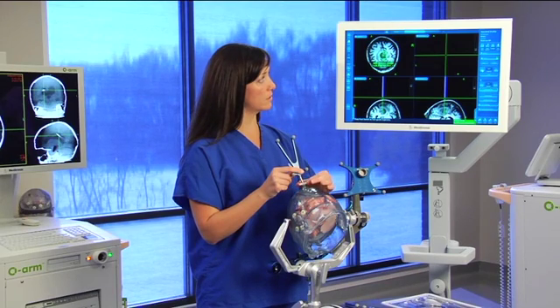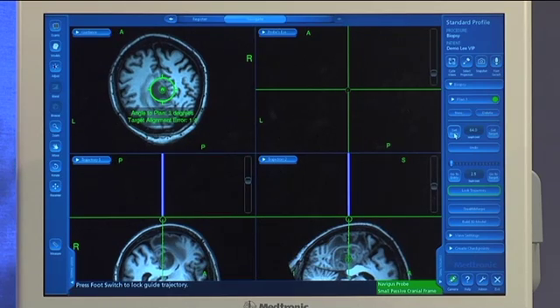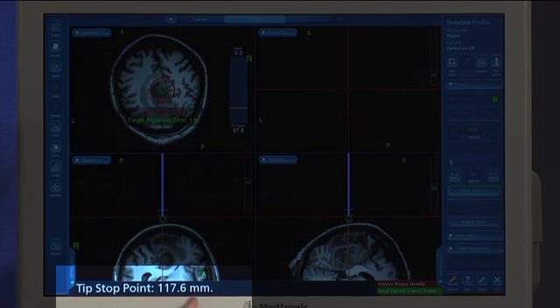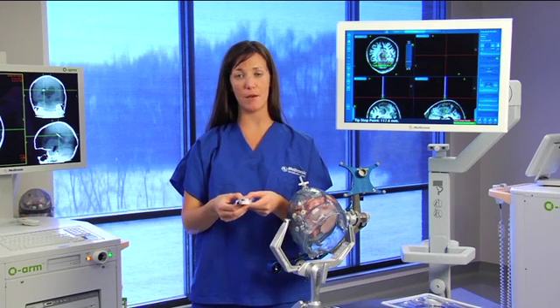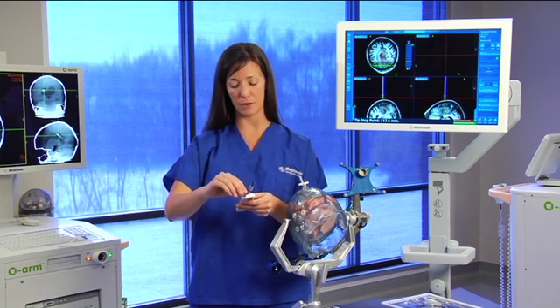Once I get down, I'm going to tighten my locking ring. Here you'll see that our target alignment error is about 1.5. I'm going to go ahead and hit the foot switch, and it's going to give me a tip stop point — it's going to tell me 117.6 millimeters. At this point, I'm going to align my biopsy needle, the center of that cut window, to 117 millimeters.